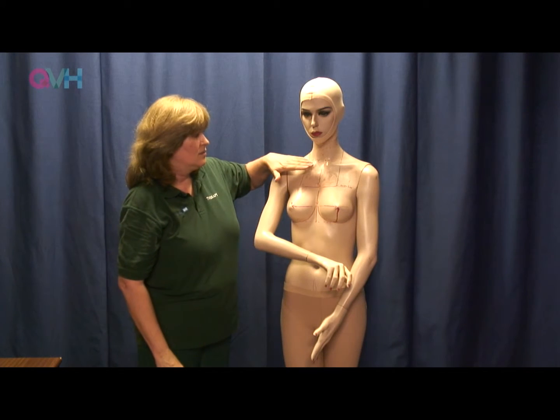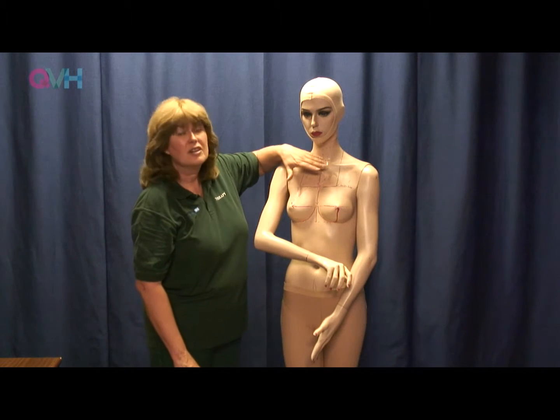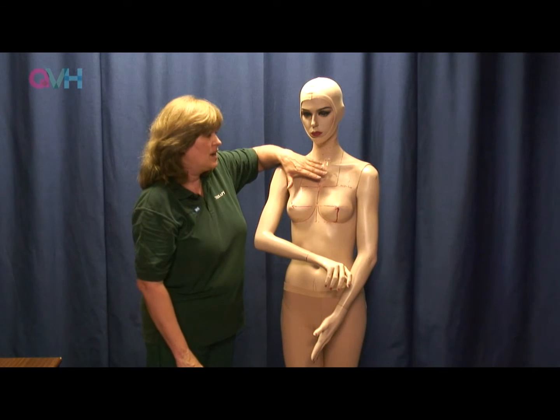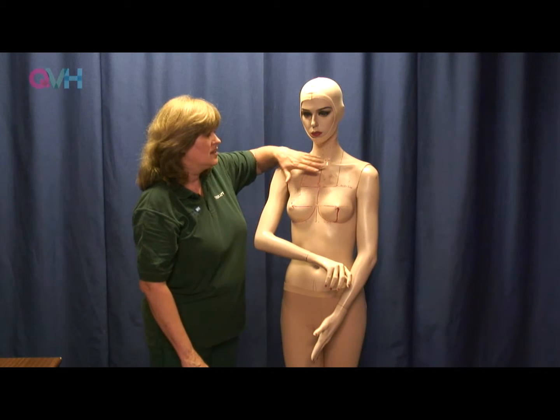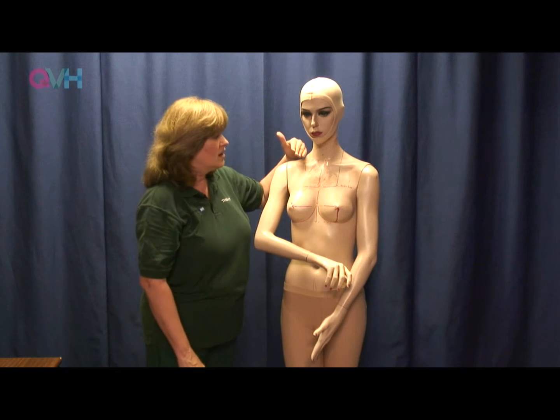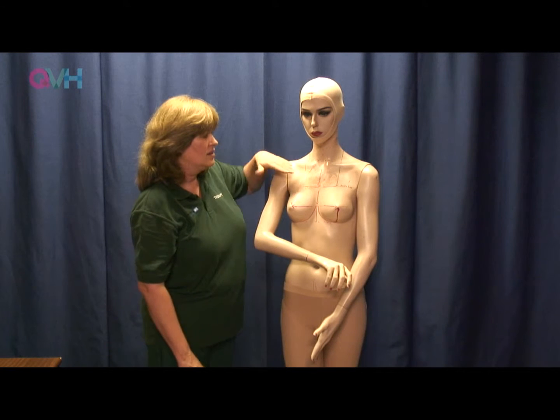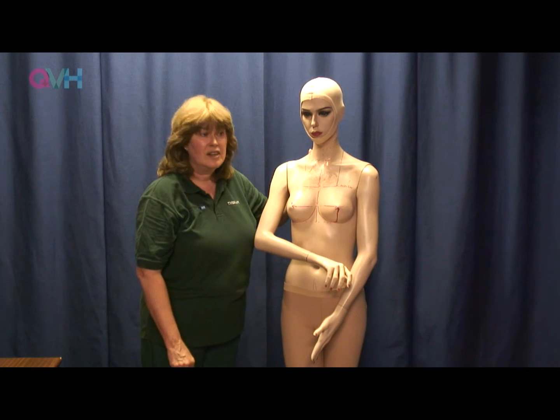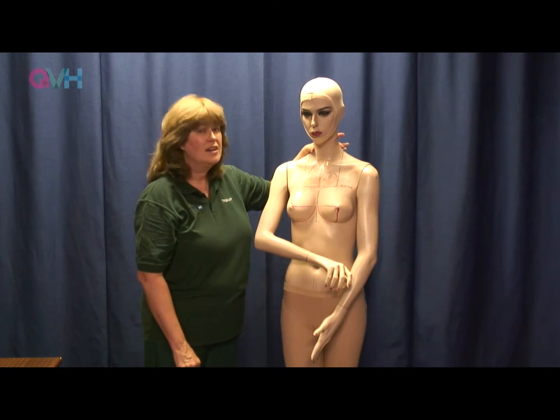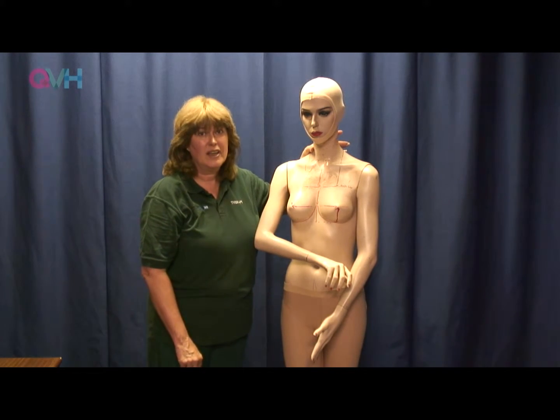And this mannequin is actually damaged in an area where many children are burned and many patients are injured that require pressure garments, and it's actually the hardest place to achieve the pressure, but a high neckline and shoulders is essential to get the contact and the covering across that area. So that's why measuring the neckline high is the first thing I need to mention and discuss and explain.